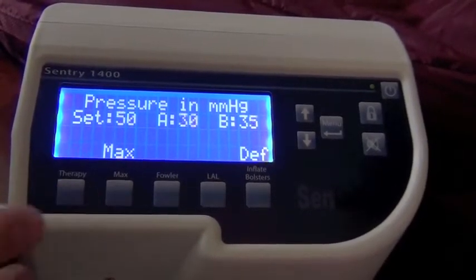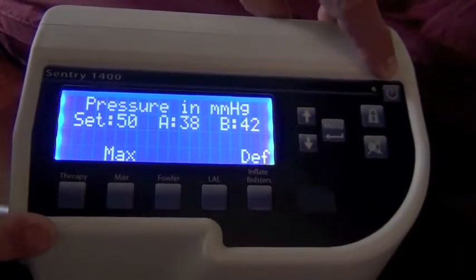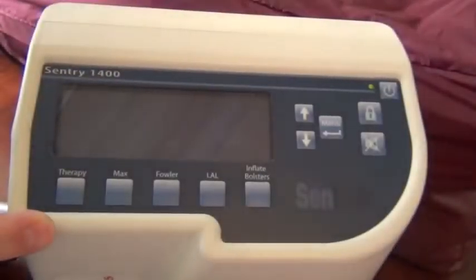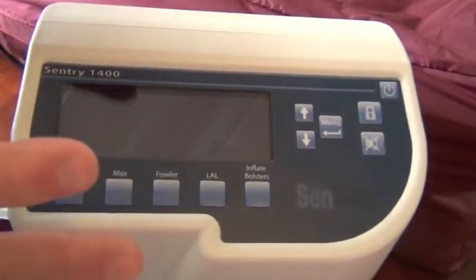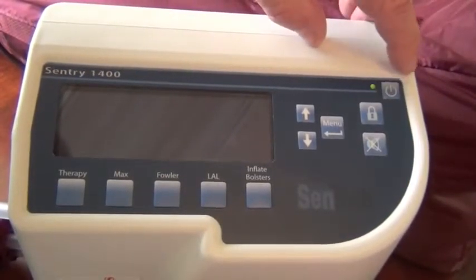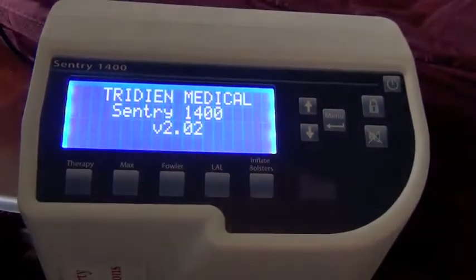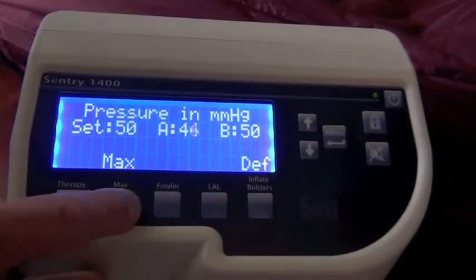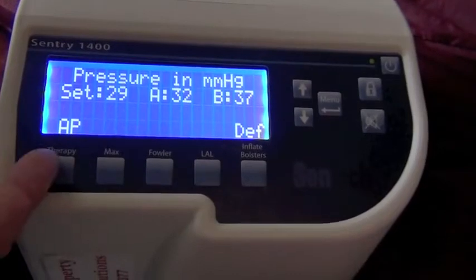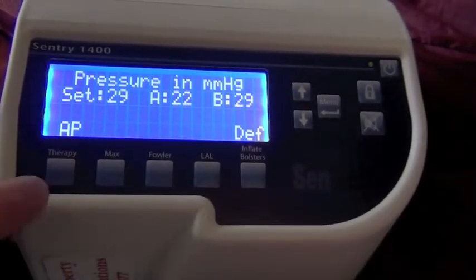If you need Max beyond 30 minutes, what you can do is power the unit off up here. This is the power button here that turns the unit on and off. If you power the unit off, it will maintain its maximum firmness for hours. So if you have a prolonged procedure, you need something longer than 30 minutes, or you don't want to be resetting that Max button, you can simply turn the unit off. When you turn it back on, you'll need to push the button to get out of Max at that point and get back into your therapeutic setting. Otherwise, it'll run another 30 minutes in Max.